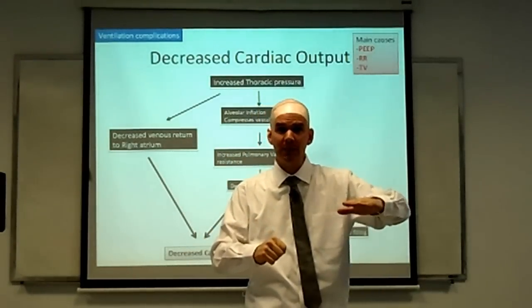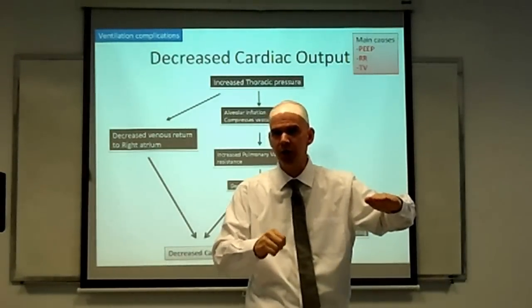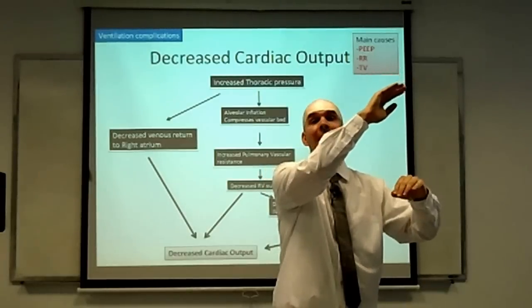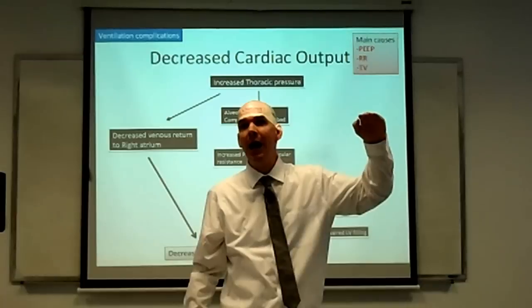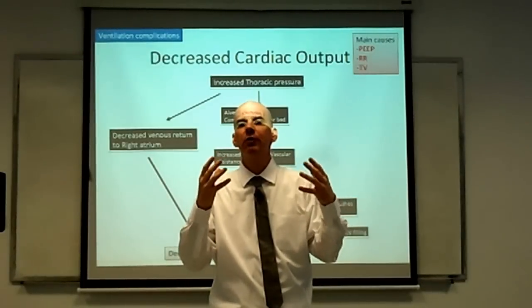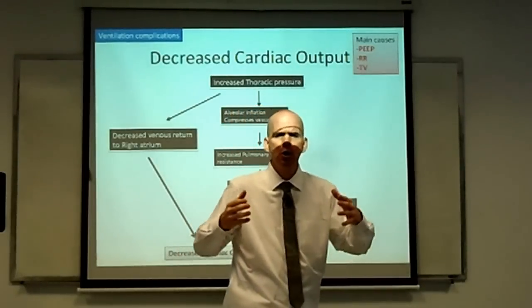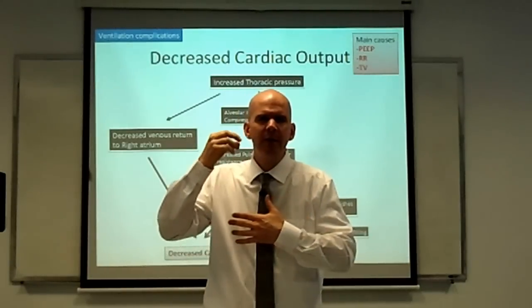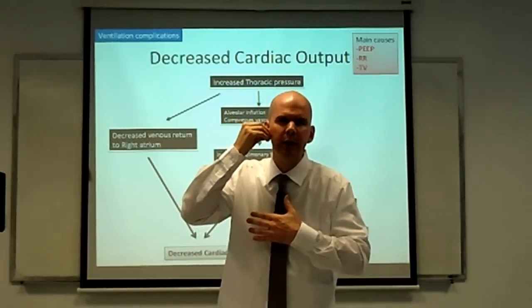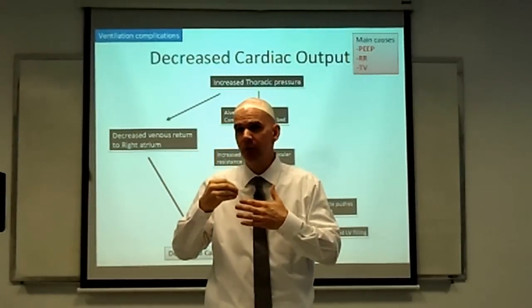So as a result of this, I'm having a higher baseline end expiratory pressure, and I'm also having a higher end inspiratory pressure. And altogether, this is going to mean a higher mean intrathoracic pressure than I would have under physiological conditions. With higher intrathoracic pressure, there's going to be less of a pressure gradient for the blood in the veins draining into the thorax.